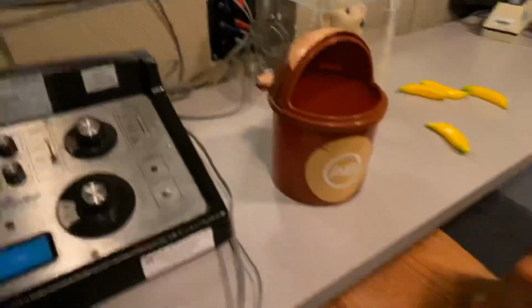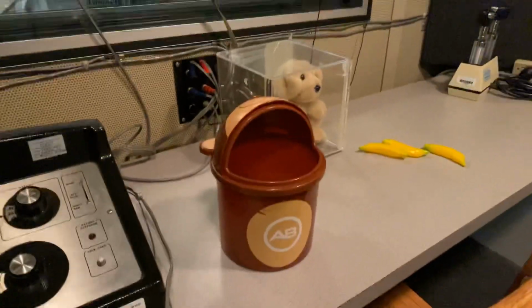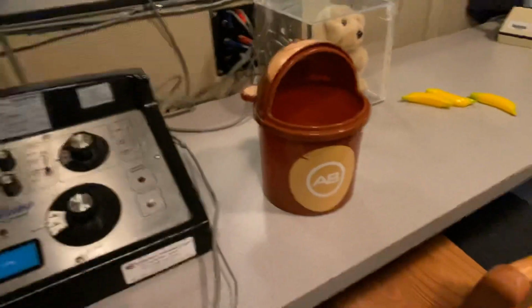Now, with that, we have to do this with the portable audiometer here. And this is where things get a little tough because I'm here at the portable running all the equipment over here. And I've got the child sitting here in the chair here. And mom or dad or grandma are sitting over there. Kids are great, but they can get distracted very easily. So this is once again a little bit where the art of audiology comes in as much as the science.